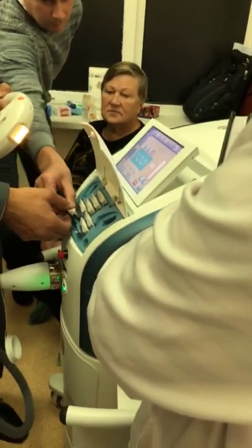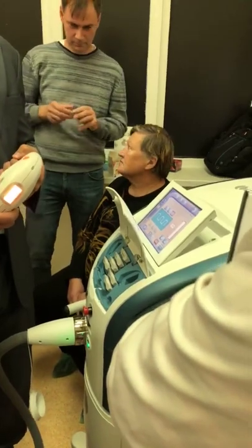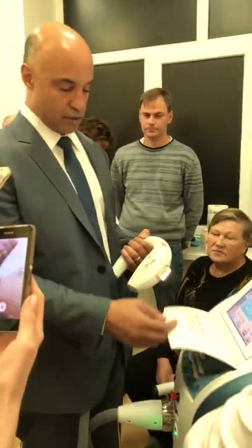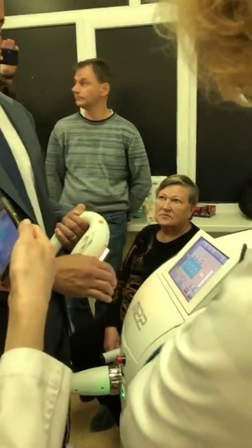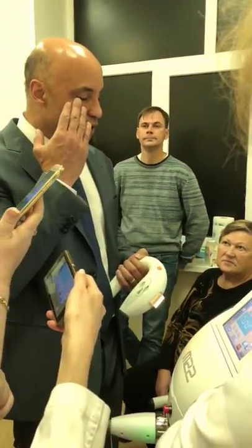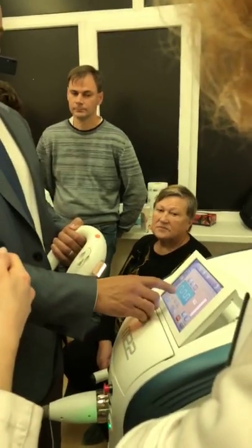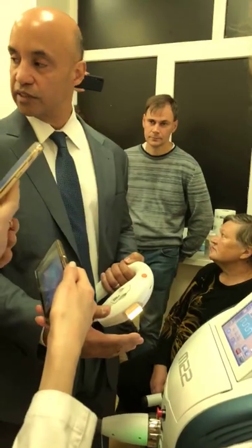And in what situation we need to decide what filter we need to use? Just always use the 590 filter. А вообще обычно используют вот это 590 фильтр for dry eye. Для сухого глаза вообще только вот это используется. So this is all set for you. And I'm actually going to program this so it's all set for you. So you always want to do multi-pulse because we're getting close to the lid margin. We always want to do 6 milliseconds of on pulse. The only time that you want to change the thermal relaxation time is darker and darker skins.